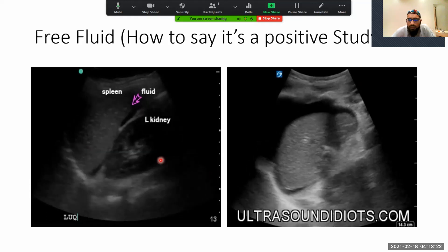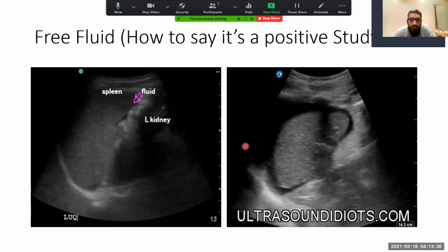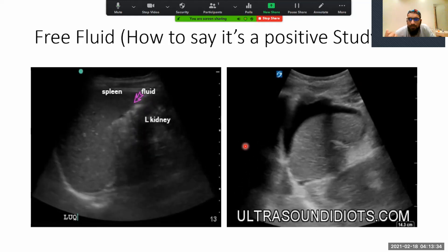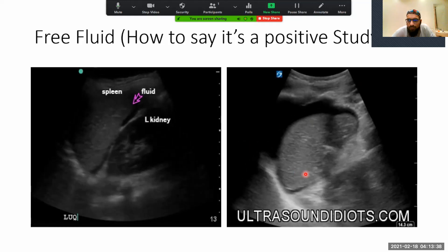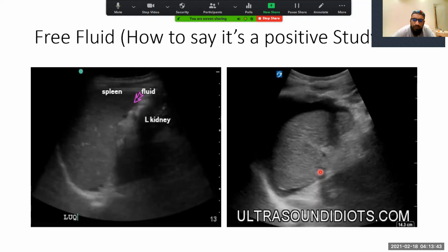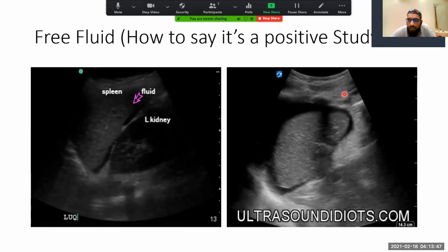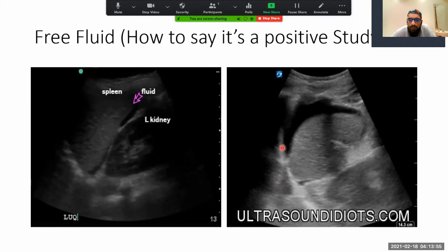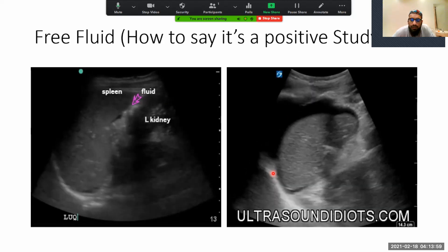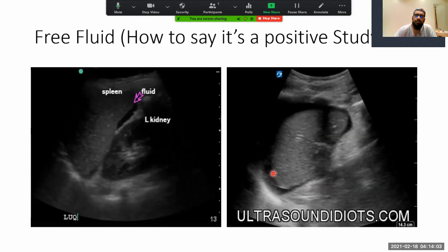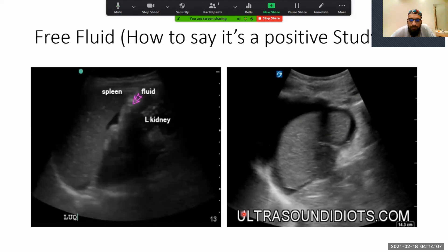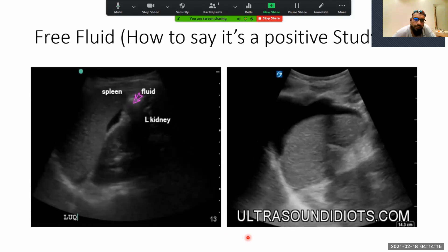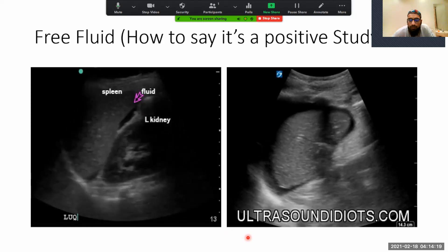The spleen is one of the most friable organs in the body — if you ever go near a spleen or see a splenectomy, it's actually quite squishy. You can almost see the splenic arteries going through if you look carefully. These are examples of what free fluid looks like. The truth is it's a difficult view to gain. Remember — knuckles to the table, get right down, and as compared to the liver you've got to go a few centimeters up. Patients who have been injured and are leaning onto the left side will actually show more fluid on that side.